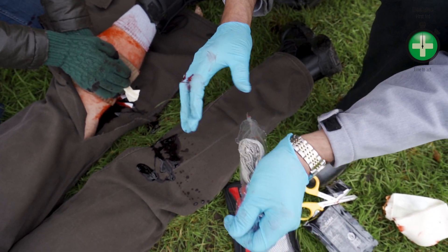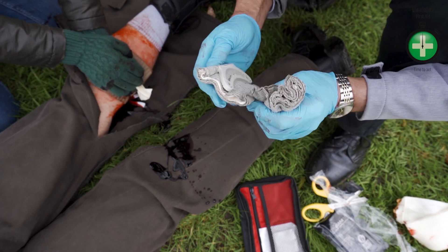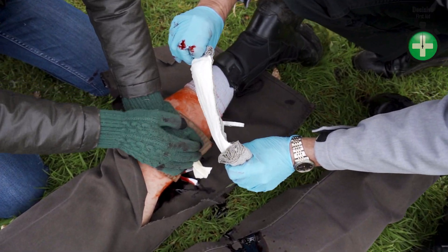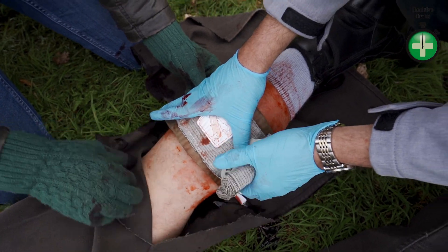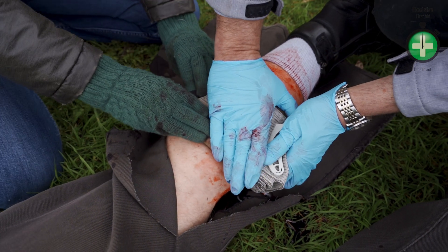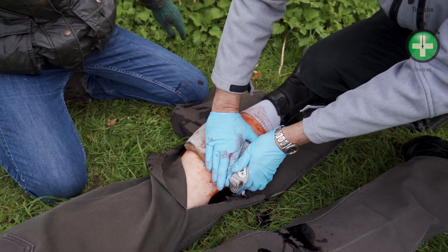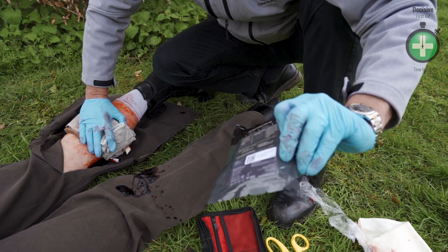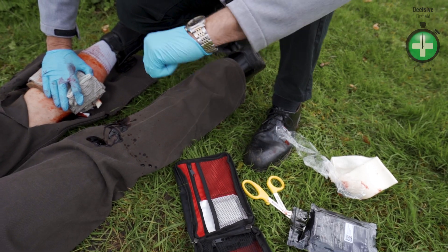Here's the inner layer — I'm going to tear that open. Avoid touching the pad. Take your hands away. I've just got to keep direct pressure on now. Lots of pressure. This particular model wants direct pressure on; it says to hold there for three minutes. So I'm timing.